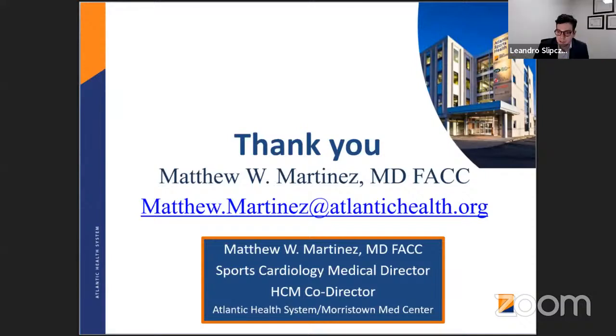Great, thank you very much. We have a question from one of our fellows, Saul Rios. He says, thank you for this interesting talk. Have you found that athletes often have an abnormal mitral flow Doppler pattern, but normal tissue Doppler velocities? So in general, I would say no, we've not seen that very much. Usually you have a normal inflow with normal tissue Doppler.